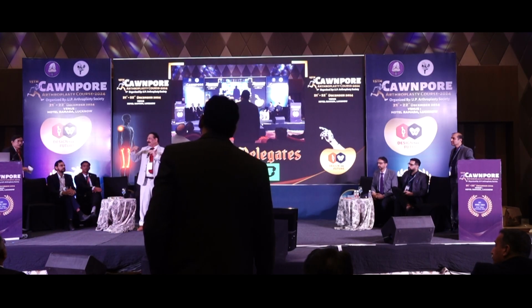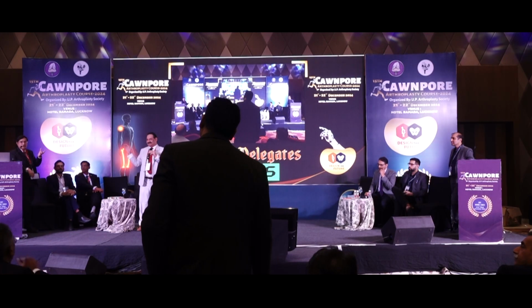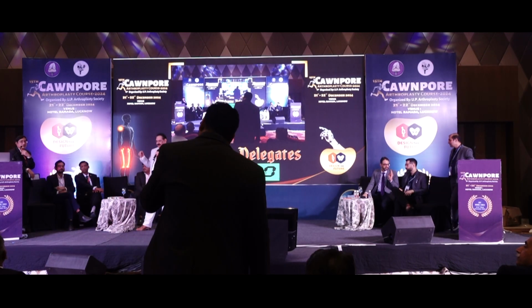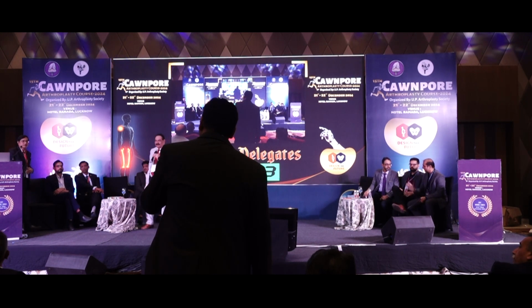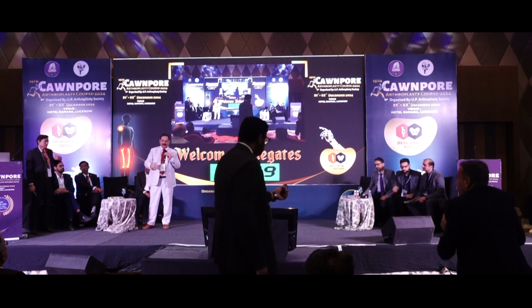Superior defect. Yeah. So I've shown you three ways of doing it. If it's a bipolar and you do not have a femoral head with you, then you need to use an augment, or a buttress there. If you have a bone bank, then you can use an allograft. So it's allograft or augment, either of these two, to fill a structural defect.